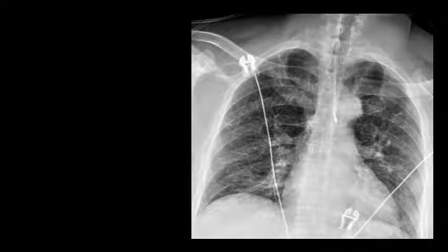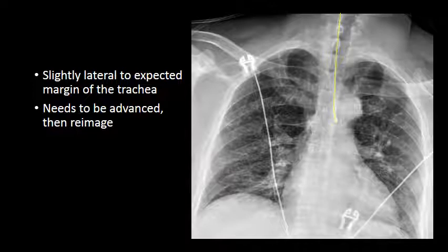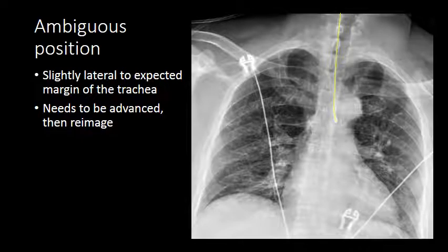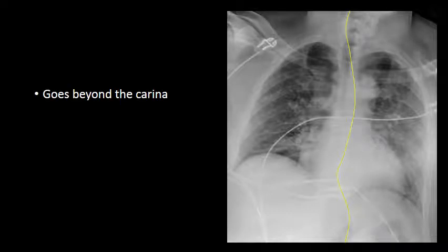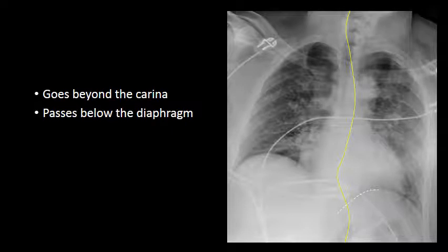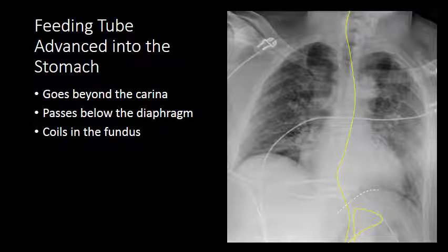Here is an example of a two-step feeding tube placement. On this initial radiograph, we see the feeding tube with the tip terminating just above the level of the carina. This tube appears somewhat lateral to the expected margin of the trachea, but to confirm its location within the esophagus, it needs to be advanced and then re-imaged. When the tube is advanced further, we now see that it courses beyond the carina down below the diaphragm, with loops of the catheter within the fundus of the stomach.